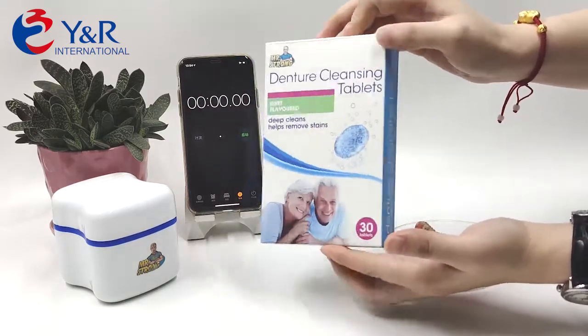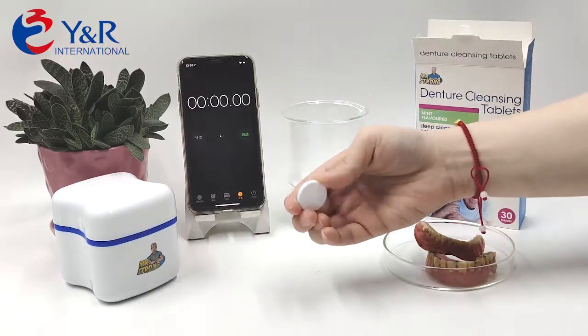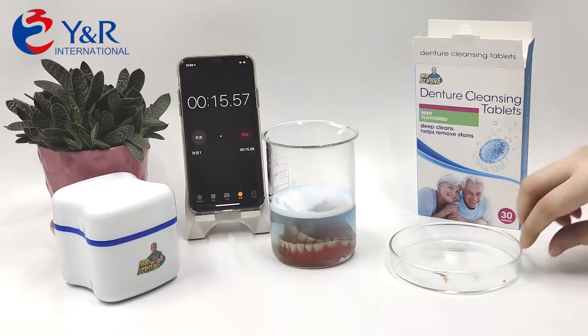Mr. Strong Denture Cleaning Tablet provides full daily cleaning care to your dentures. The tablet is packed with foil bag individually, six pieces per sheet, with easy tear-off lines.